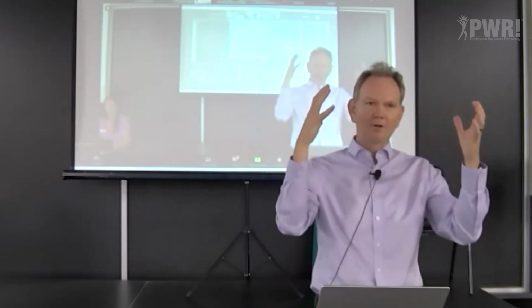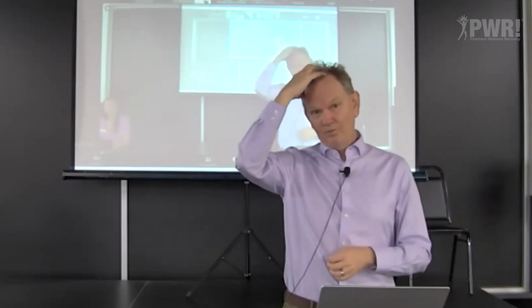If you have a thin scalp, which some people do, you may see a little bit of a bump there. Now, if you've got a normal hairline, that's not a problem. If you're follicularly challenged like I am, you might see a little bump there. You can definitely feel it. If you feel the top of the head, you'll feel a bump there. So there's two bumps there. The wires run under the scalp.